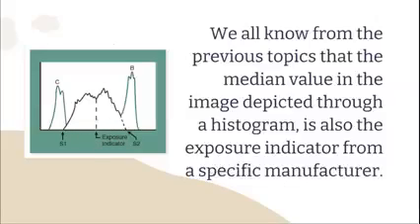Okay, so the target exposure indicator and the range of acceptable exposure indicators are all based generally upon the median pixel value in the image, determined by each manufacturer's particular method. So provided na siya na ang ideal na exposure is nasa middle sa histogram, mao ni ang iyahang value, and the exposure indicator scale surrounds the median exposure value. Nagadepende na siya sa inyong exposure indicator, ideal exposure indicator, target exposure indicator. Okay?